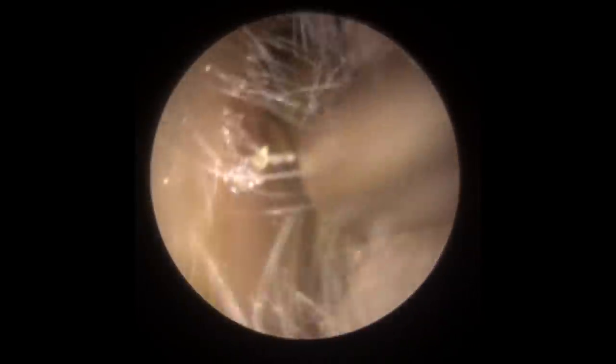What you can see is we've got quite a narrow-ish entrance to the canal and we've got some quite hard wax in here, which we're just using the standard size Zolna tube to remove. And, as you can see, we've managed to get a good grip on this outer section here.